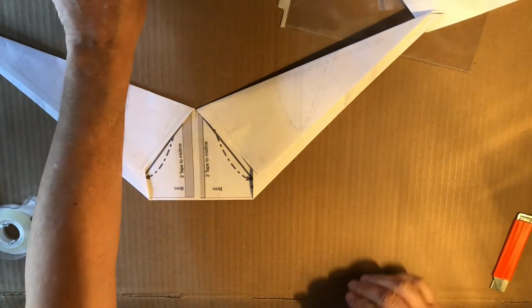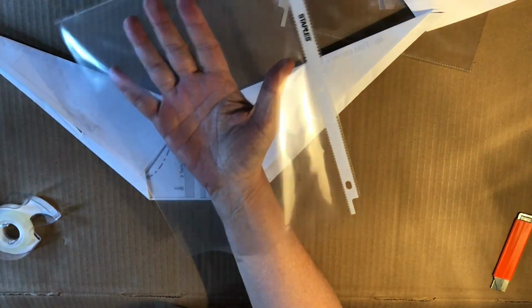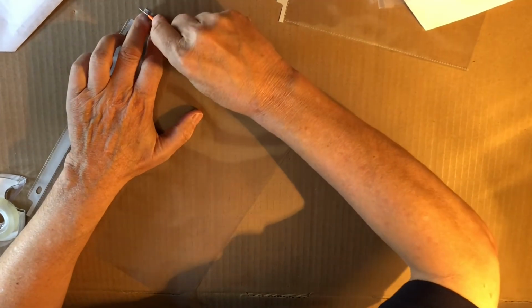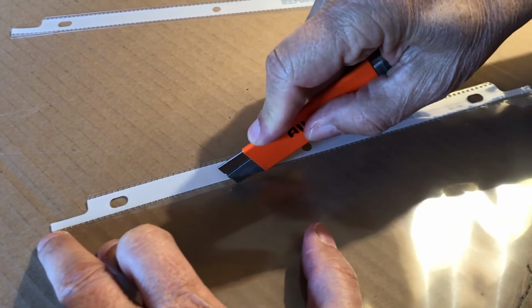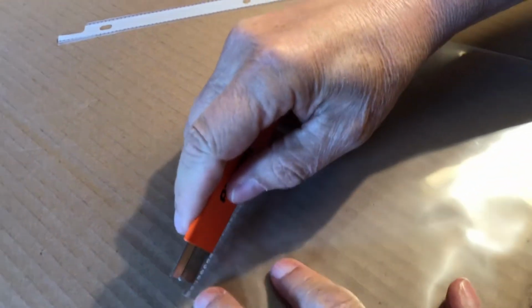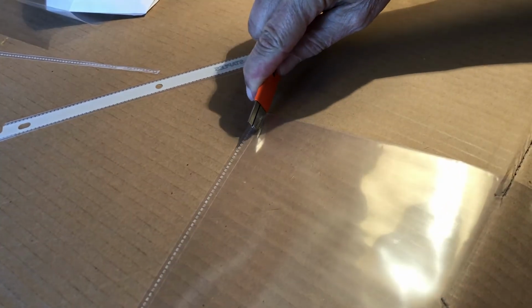Okay, now I have here these sheet protectors, as they're called. I think this is medium weight clear. As you can see, it's clear. It's not transparent the way overhead transparencies would be, but it's still good. And what you want to do is take advantage of this seam, which you'll leave intact, but you want to cut away just on the interior of these serrations so that it will fold out. You may be tempted to cut along the serrations, but you'll find that if you do that, the thing is still sealed. So we cut just along the inside of the serrations. Okay, so now you see you have a nice big face plate.